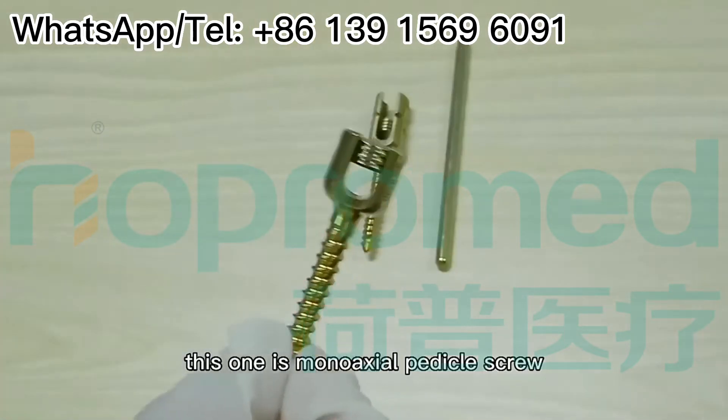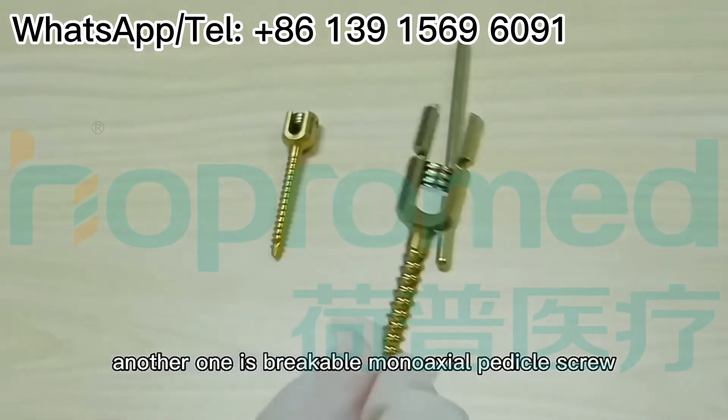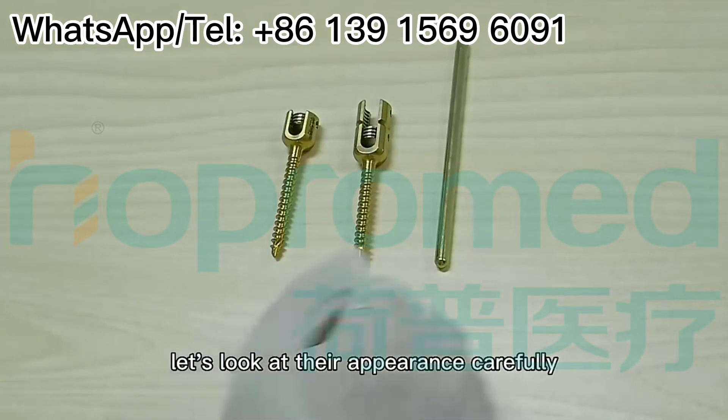This one is a Mono-axial pedicle screw, and another one is a breakable Mono-axial pedicle screw. Do you know the difference between them? Let's look at their appearance carefully.